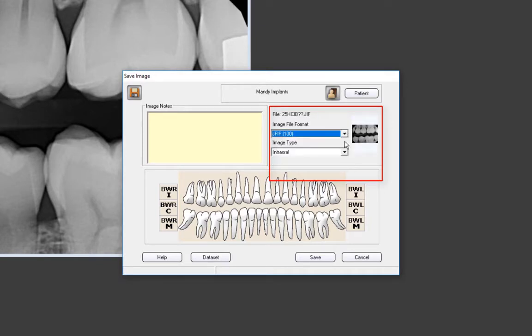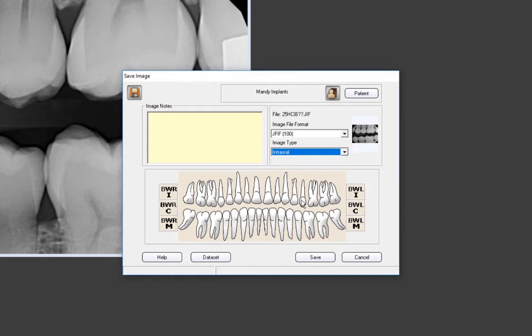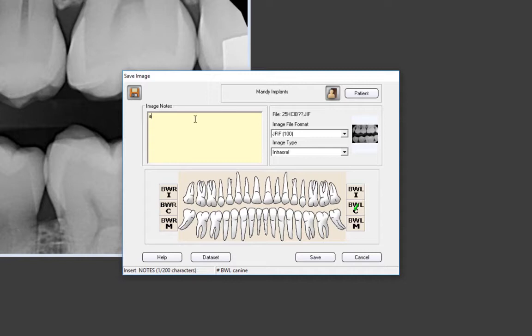You can also choose the image type. Next, select the location of the image in the tooth chart area. A green check mark will appear to indicate the image has been selected. For this example, however, we'll select one of the bite wing positions. Let's choose Bite Wing Left Cuspid. The other two bite wing choices for the patient's left side are for an incisor or a molar. In the Image Notes area, add any notes that you would like to be associated with the image.